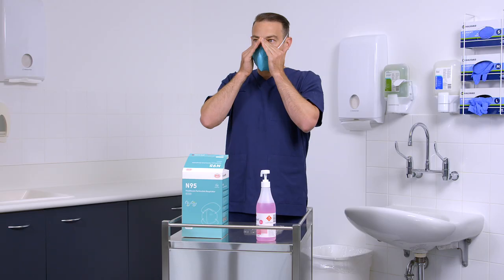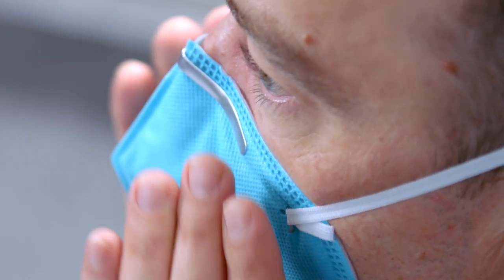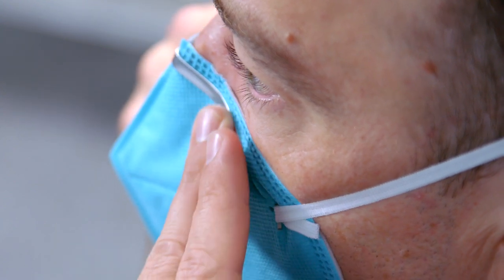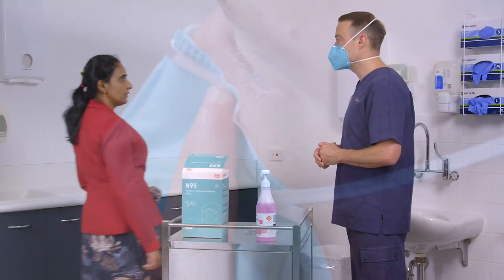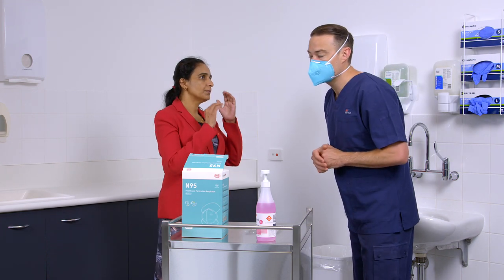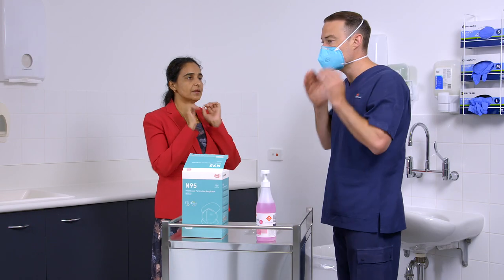If air leaks, reposition the respirator, tightening the metallic strip and reposition the elastic bands for a better fit. If air leaks around the nose, readjust the nose clip to eliminate leakage by repeating earlier steps until a tight seal is achieved. If you can't achieve a seal, ask a colleague if available to check that the straps are not twisted or for hair or earrings that might be caught in the seal. After making adjustments, repeat the fit check.